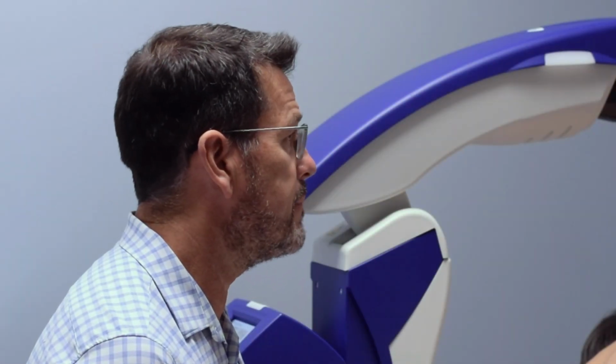Someone said to me a couple years ago that 10 minutes of therapy under a laser is like about an hour of icing an acute or subacute injury. So getting an idea of what it does is kind of akin to using ice to reduce inflammation, and in certain cases heat to improve blood flow. So both of those things are going on.